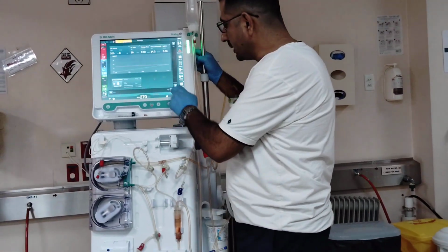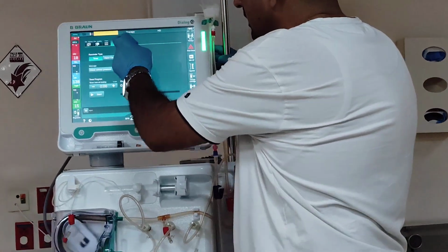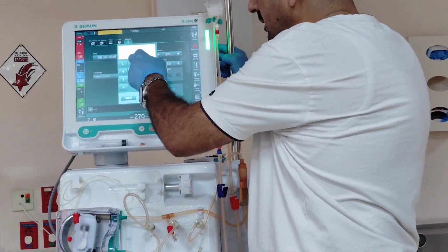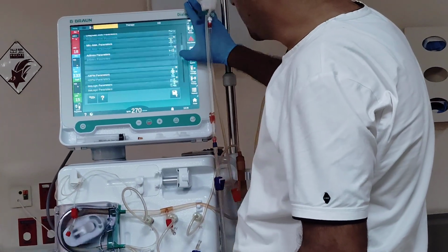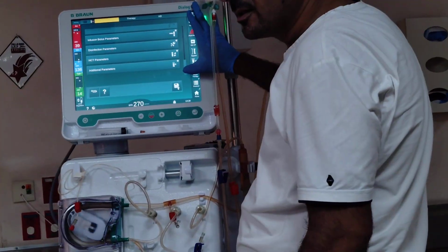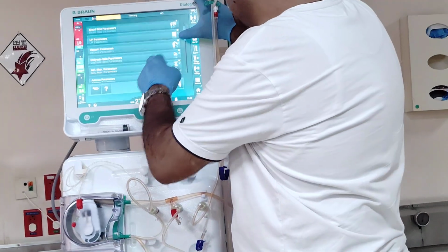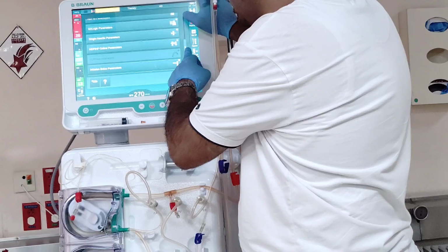As we mentioned before, here we have the setup screen. In the setup screen, you can choose the setting, and here we have the user setup. By pressing here with a special code, you can change some special parameters as the super user. Okay? So here for the disinfection, suppose I have a system clot and I want to change the lines in a safe way.